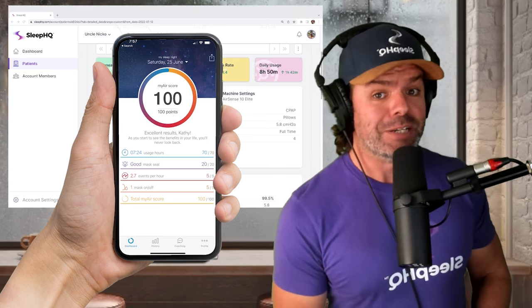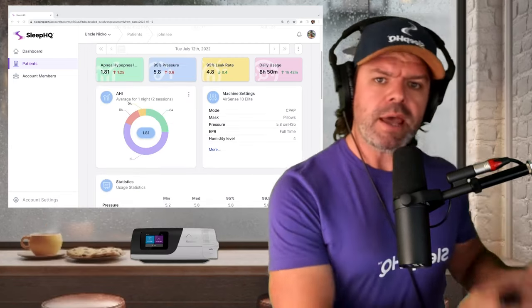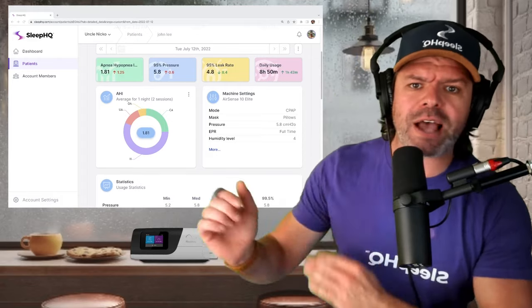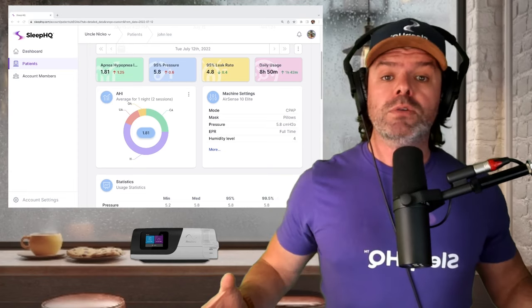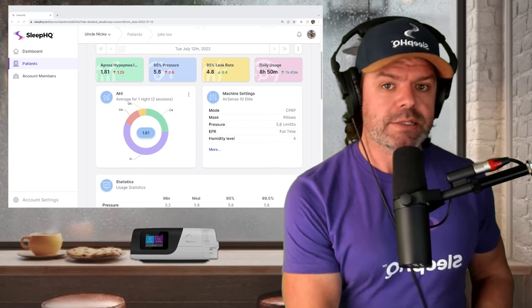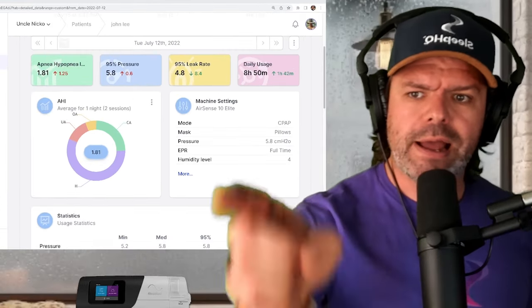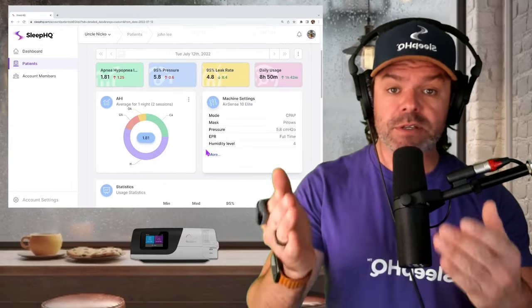If you opened up the MyAir app, it'd show 100 points — a perfect score. If you had an appointment with your specialist, they'd open up AirView and it'd be congratulations, high fives all around. It's because the AHI is below five that they make the assumption that your sleep-disordered breathing is adequately treated. But you know what they say about assumptions. No more assumptions — we don't need to make assumptions, we have SleepHQ.